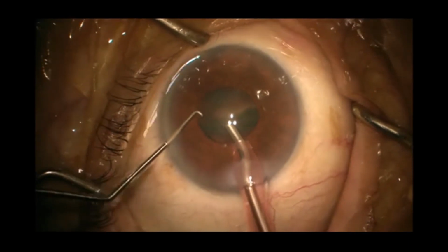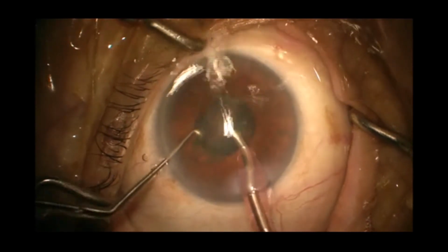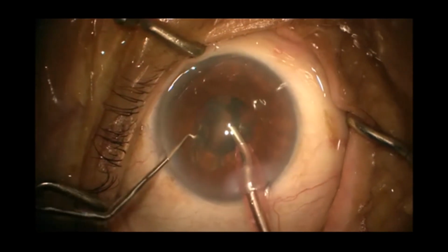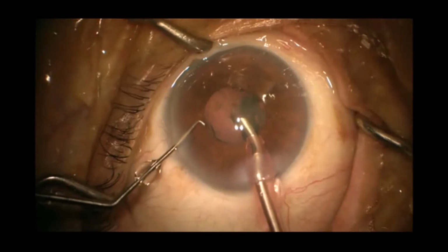And see how beautifully we are able to phacoemulsify the whole lens.